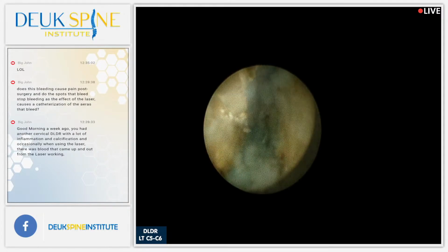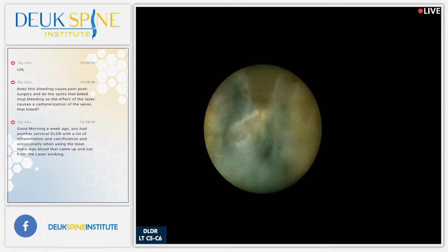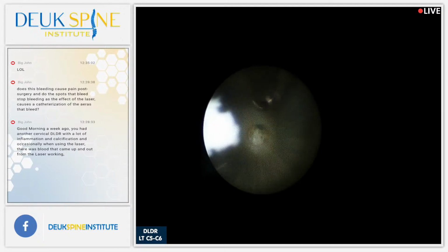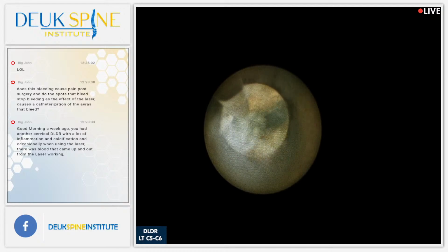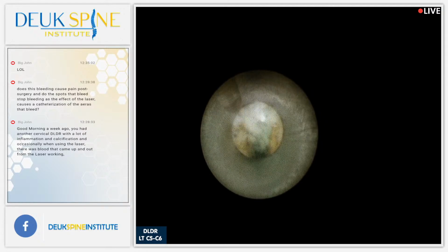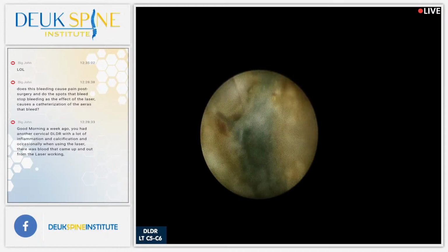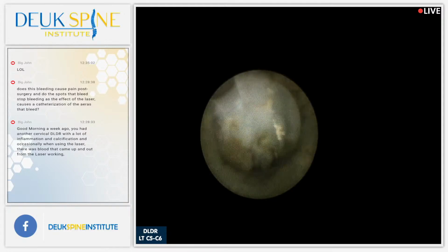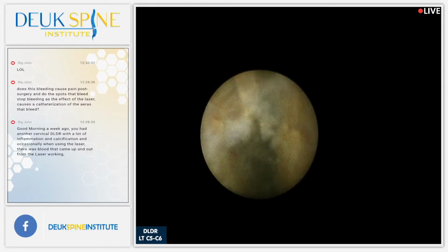Not bloody like a lot of blood, but we're talking a few cc's because these bone spurs are very, very small. And that can definitely cause pain. The problem with blood is that as it breaks down inside your body, it irritates the tissues and causes inflammation, which is why we try not to get too much blood. We try to irrigate it out. But every surgery is going to have some blood that's left in the patient. It's impossible to do surgery without bleeding. The surgery we do here is the closest a human being can get. It's a bloodless surgery. Which laser are we using? 60? 60, yeah.